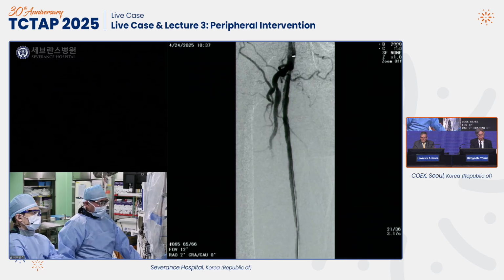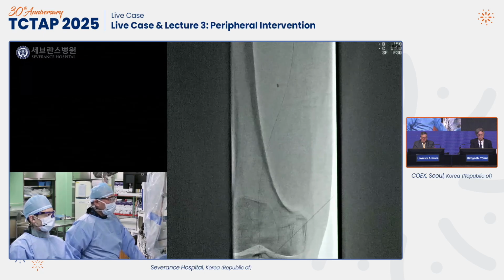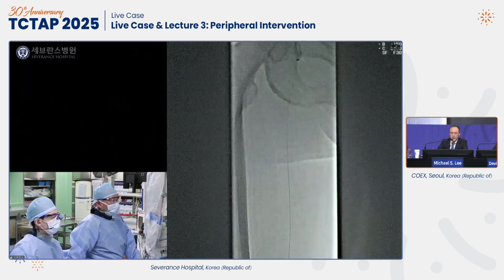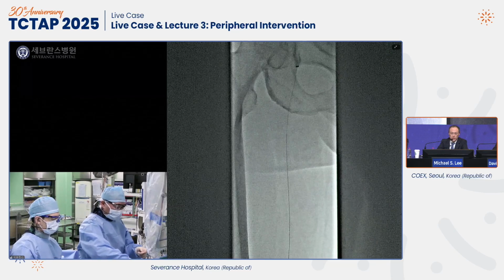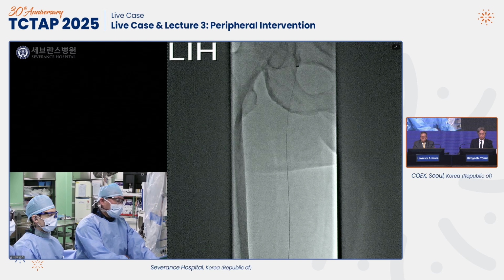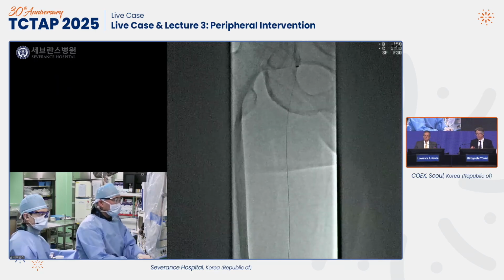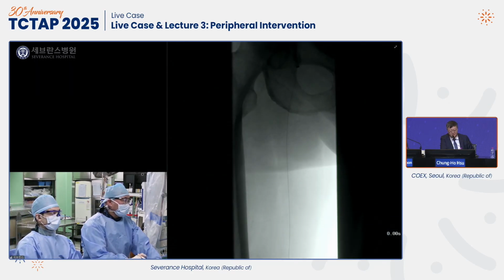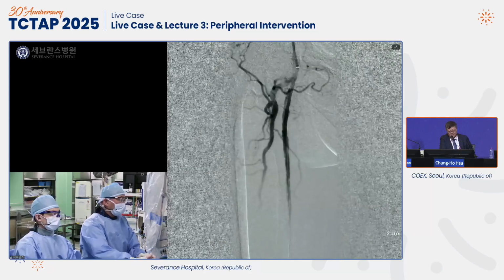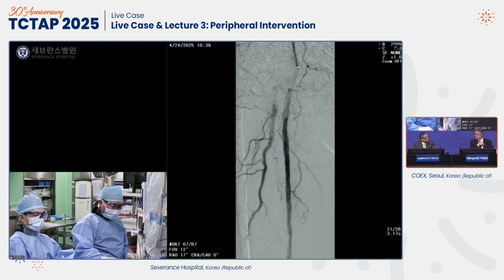Okay. So I think I will treat this lesion with a 7 millimeter balloon. What's your concentration of contrast and saline when you do your DSA? 1 to 9. So 1 contrast and 9 saline. Wow, that's good. And so is there IVUS image after the balloon dilatation after DCB? Yes, I will do it. Yeah. There you can see the dissection. I think it's a great example of obliquity. Really does show things in a nice way.